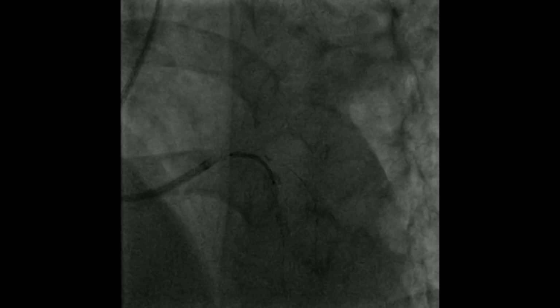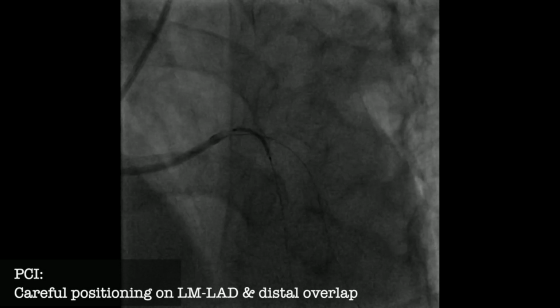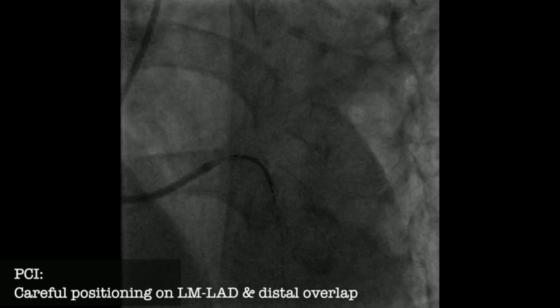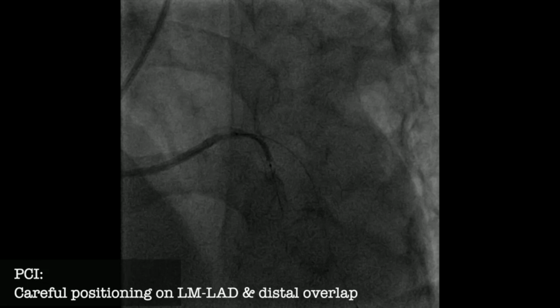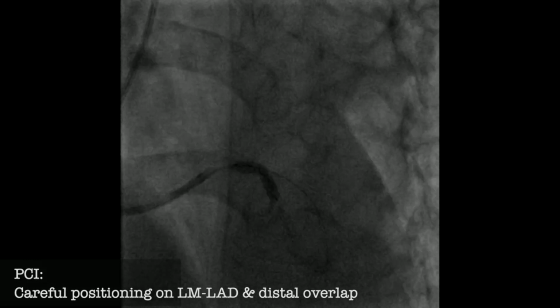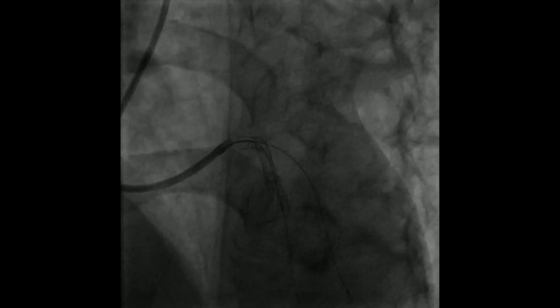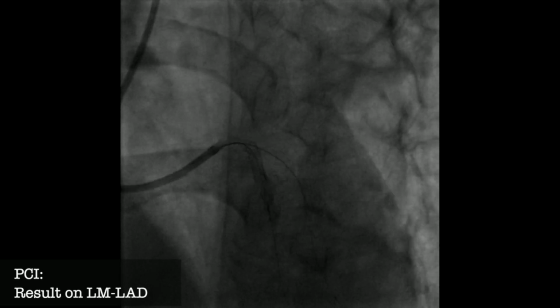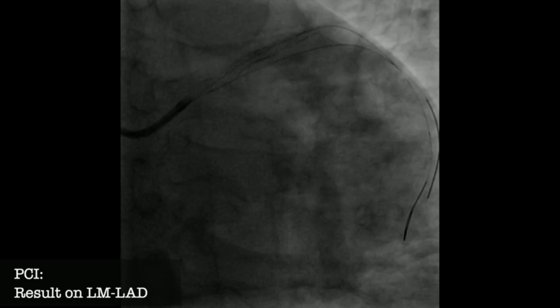Well, we don't have the data. The data is strongly in favor of paclitaxel eluting balloon, all the data I share with you, but there is coming data from small randomized clinical trials suggesting equivalence with the limus drug-coated balloons, that are 3 or 4 of them. Okay. Yeah, that's true. We don't know. So the answer for you is we don't know.